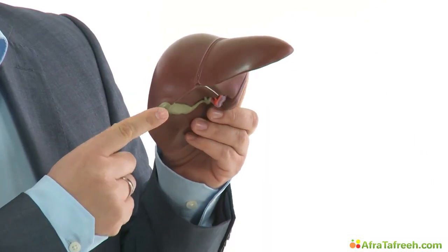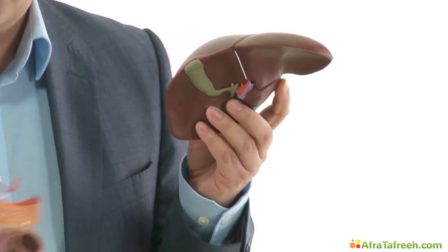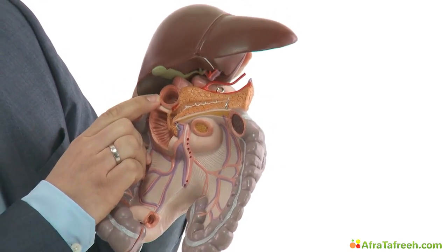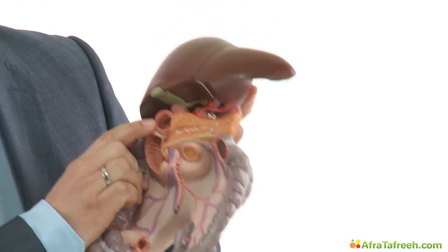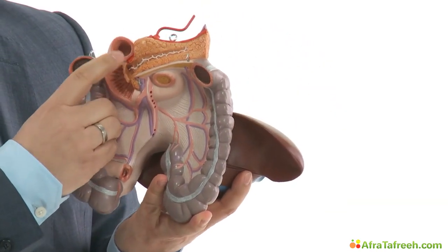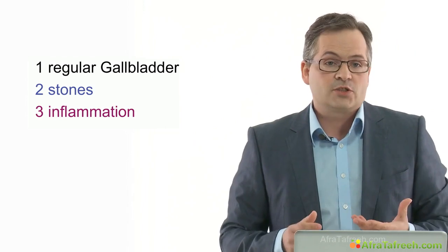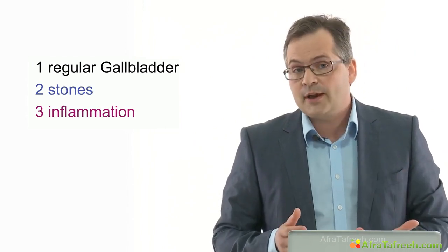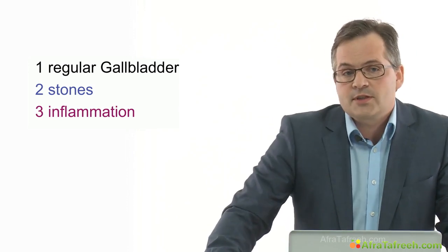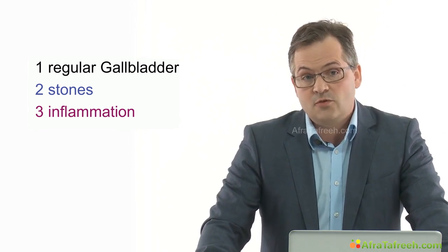The gallbladder is bordered by the liver, mostly segment 4, and by the bulbus of the duodenum, which you can see here. This regularly contains bowel gas, and sometimes it's difficult to distinguish between bowel gas and stones in the gallbladder, but more on this later. Also, the head of the pancreas is nearby. In this chapter and the following one, we will discuss the sonographic depiction of the gallbladder and what a normal finding looks like. But we will also describe how gallstones can be recognized, and what the signs of an inflammation and of tumors are.